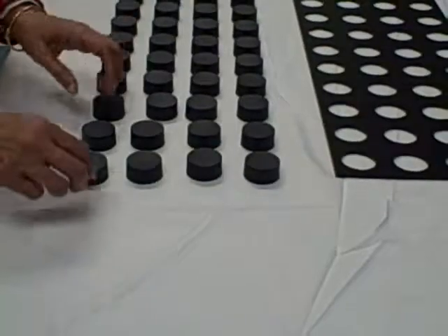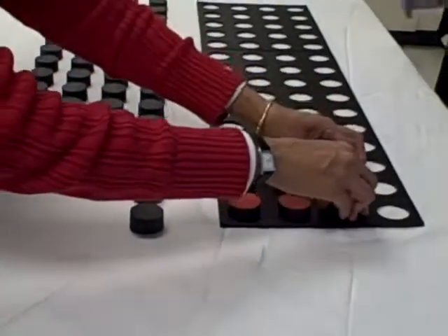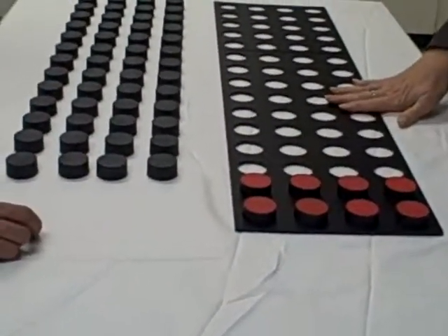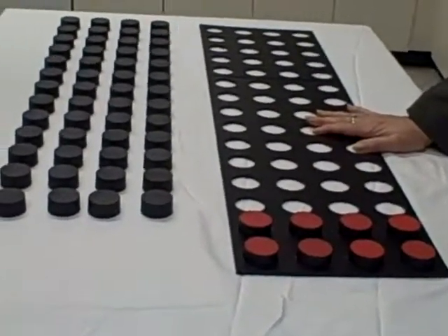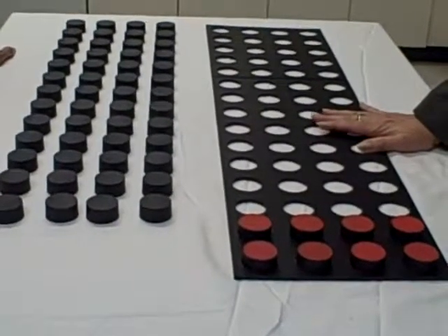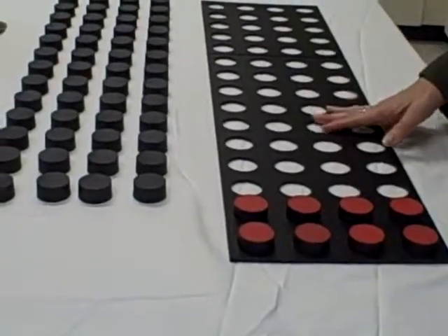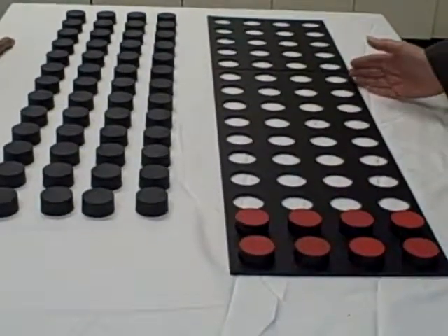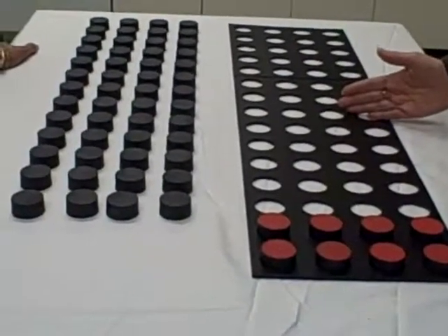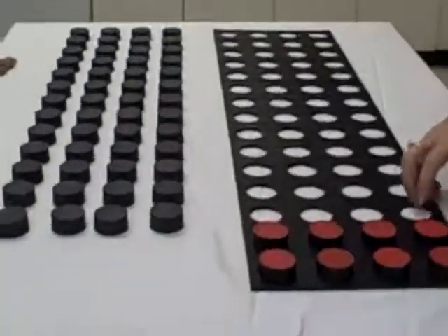Okay, ready, go. Okay. So you can see there's a lot of things that you can do with this test. It's very time-consuming to do this test, actually, the way it was meant to be administered. But it's a good treatment technique, and a lot of therapy clinics will use it, do any particular subtest, sometimes only a portion of it, not worrying about the whole thing, but doing something consistently, and then timing it on multiple visits and comparing progress. Okay. All right. Thank you.